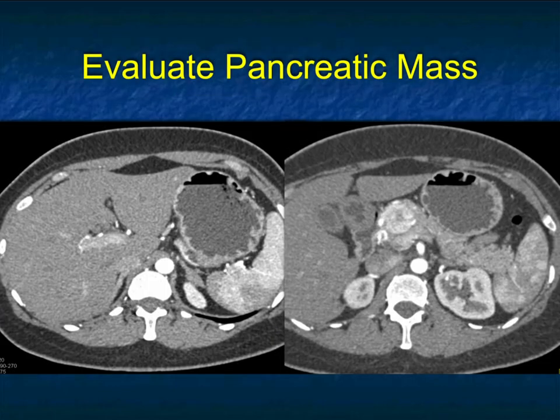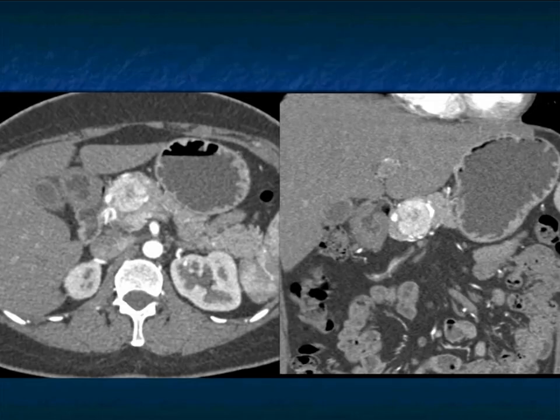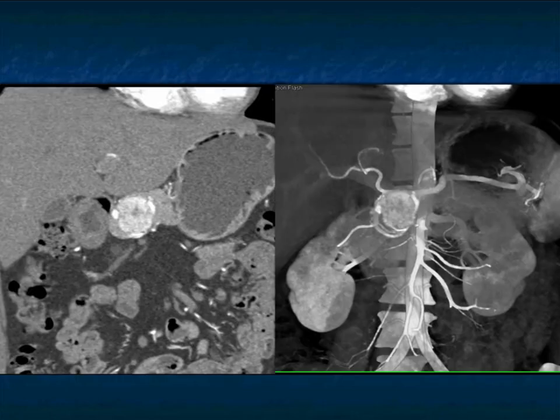So here's a nice example, pancreatic mass right near the head-body junction. Very vascular. Again, neuroendocrine tumor is a good thought. Metastasis if the patient had an absent kidney or had renal cell carcinoma. And this was a neuroendocrine tumor. There is some cystic component. There's no dilated duct. There probably looks like a second lesion. If you have two lesions, then either you're dealing with neuroendocrine tumors or metastasis. Mentioned mets most commonly from renal cell carcinoma, very vascular.